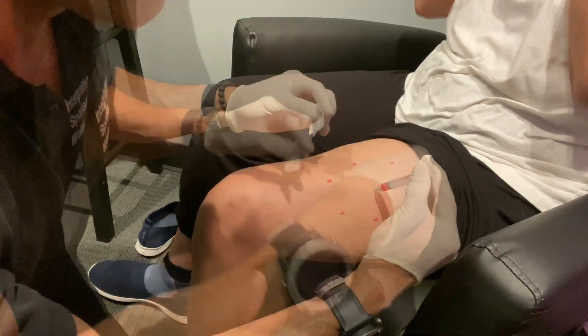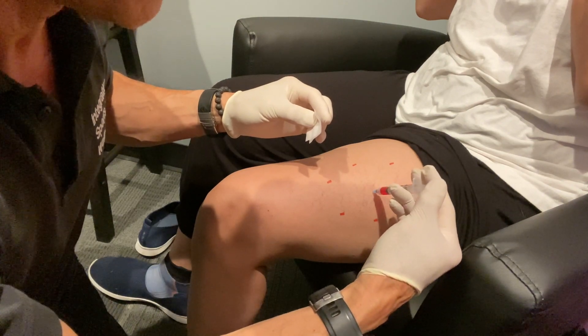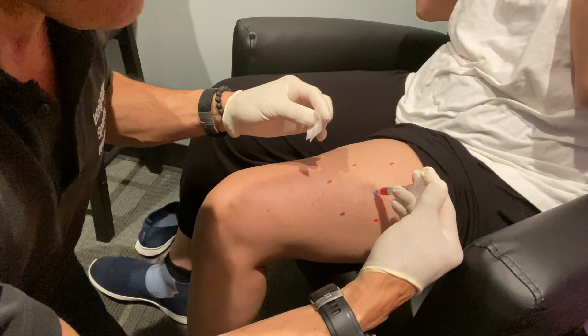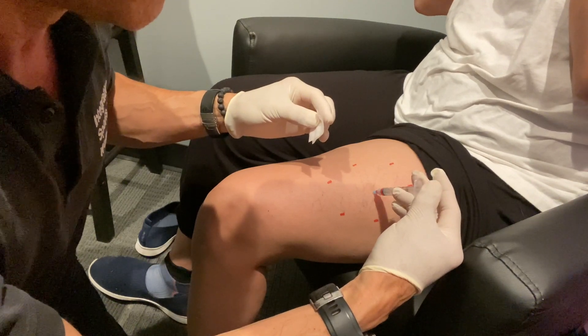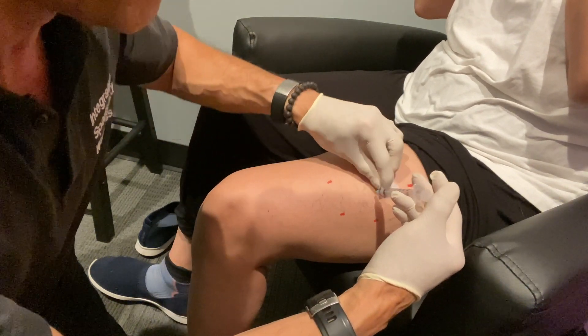Aspirate a little bit just to make sure we're not in the vein. And then allow the B12 to enter into the muscle. And then we're good. Out.